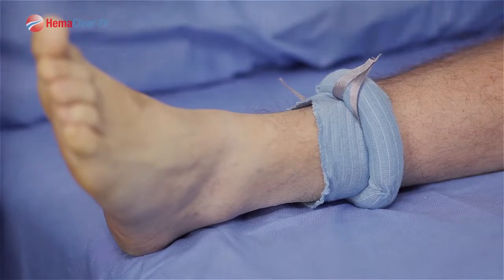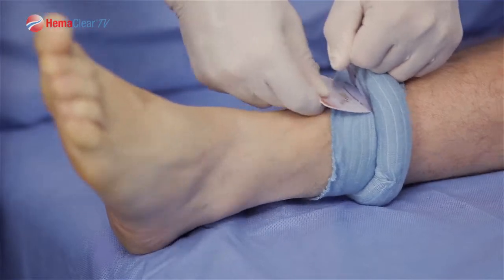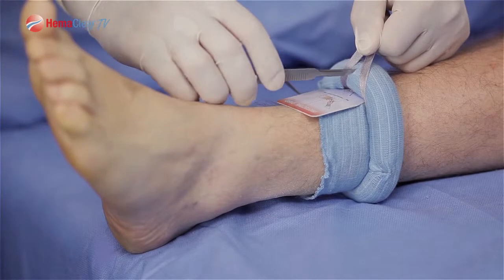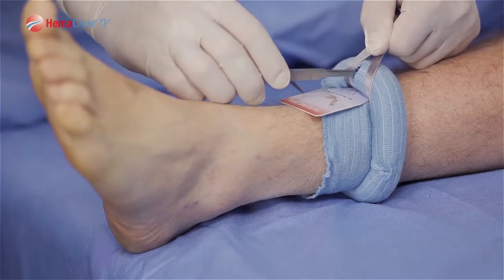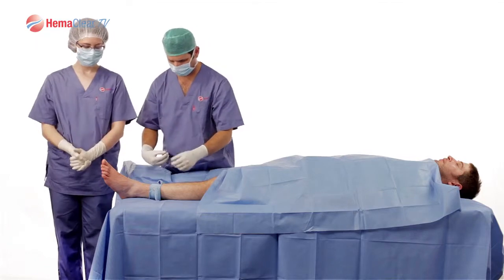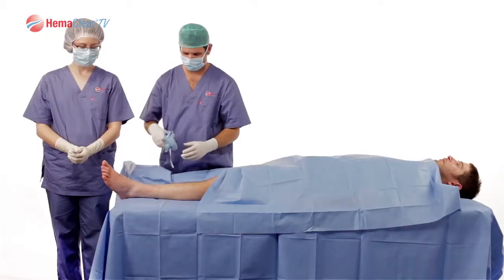When you would like to remove Hemoclear, place the cutting card from the distal side of the ring under the Hemoclear. Utilizing a knife, cut the ring in slow, orderly passes. Once you are through the internal silicone ring, you can utilize scissors to remove the rest of the device. Your tourniquet is now down. Note the tourniquet time.